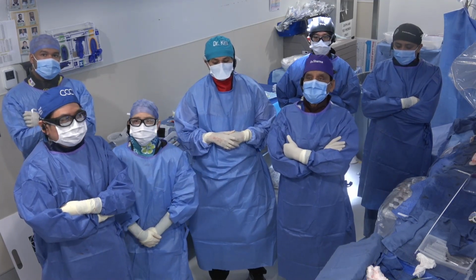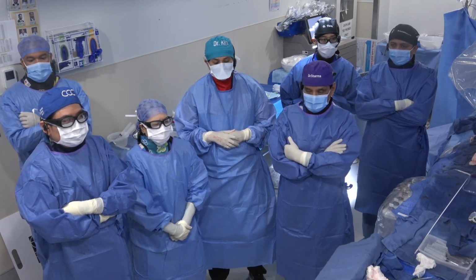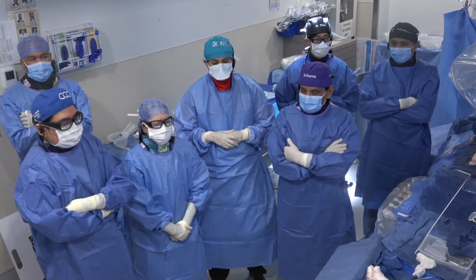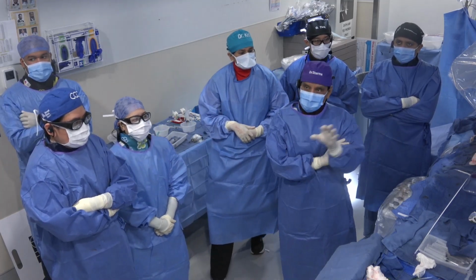What is your protocol for a sentinel device in valve-in-valve? Because the stroke incidence is relatively much higher in valve-in-valve. He said that he's answered that. He said 100%. Like this case, not a question. Because these are the patients who will get trouble.